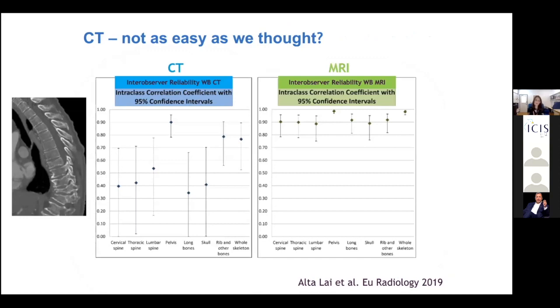Now, as I alluded to, not everybody has access to whole body MRI yet. So a lot of centres moved from skeletal survey to low dose whole body CT. And of course, CT is better than skeletal survey. But in fact, interpreting CT in this often older population of patients is actually not always that easy, because differentiating true bone lysis from osteopenia and degenerative change is quite difficult.